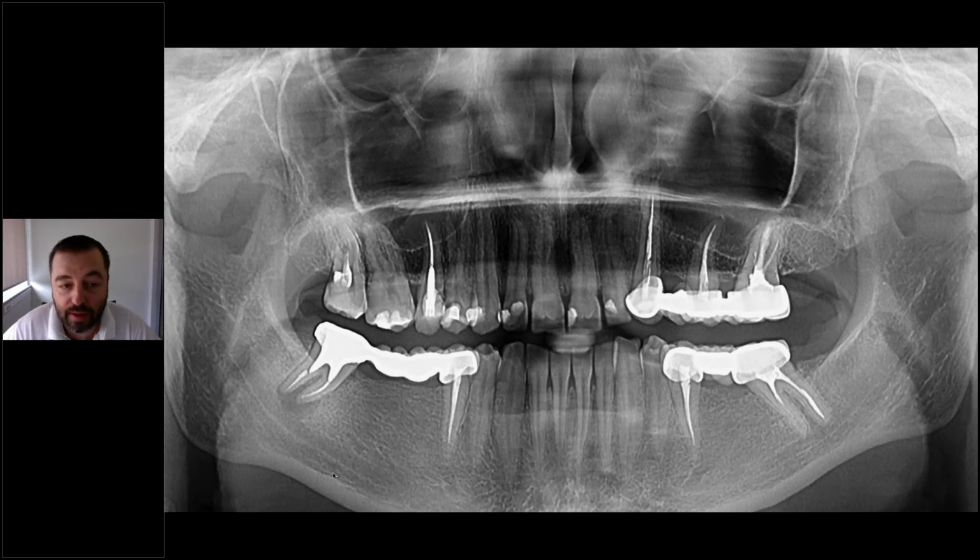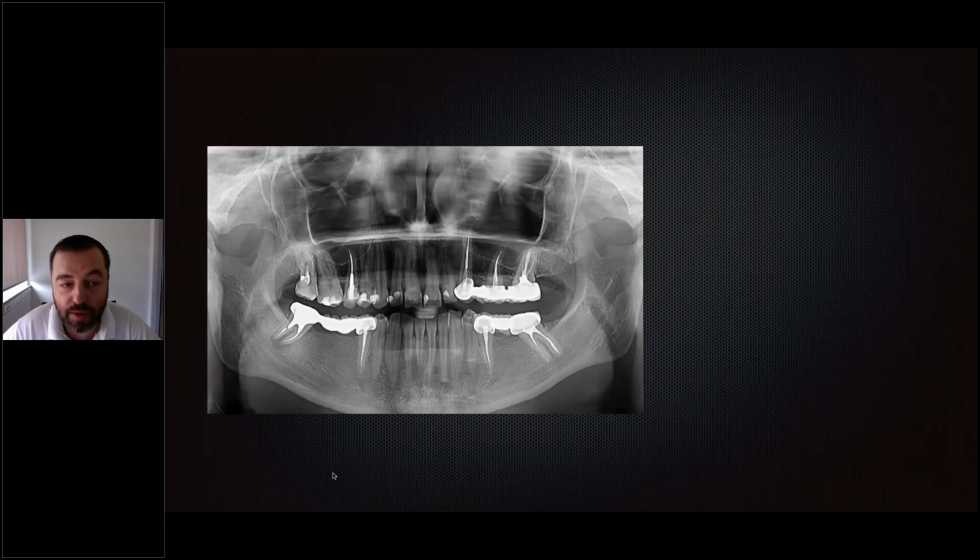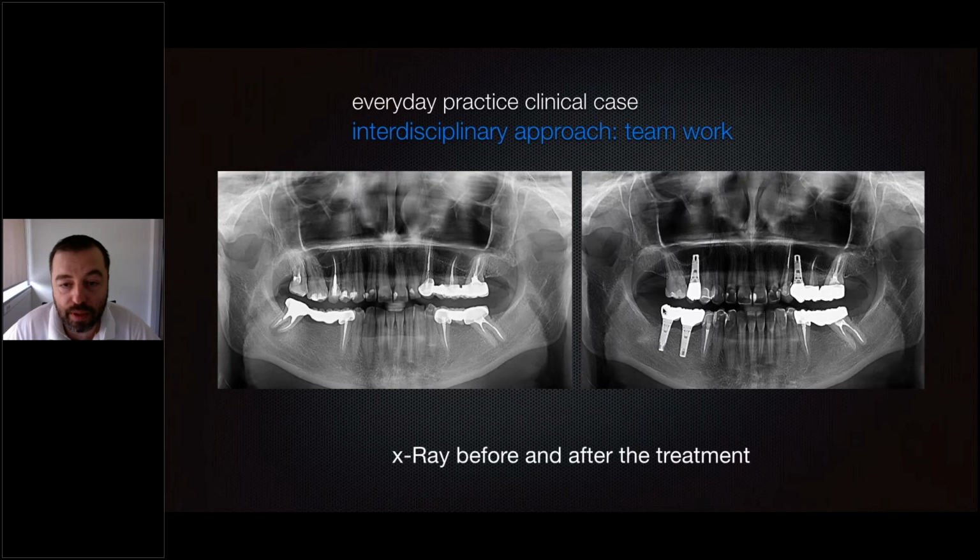And this is our treatment. So here we lost one tooth and the molar, one implant with internal sinus lift here, another implant inserted post-extractional here, the other two teeth retreated on the second quadrant here, just retreatment, and two implants placed on the fourth quadrant.